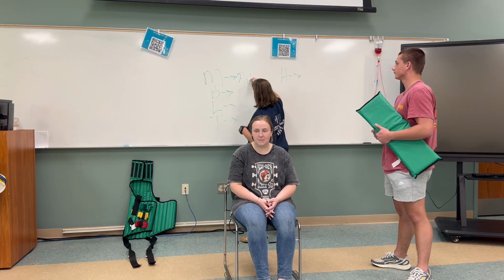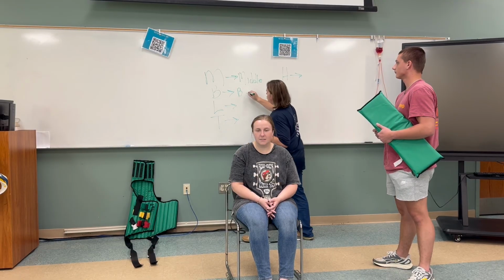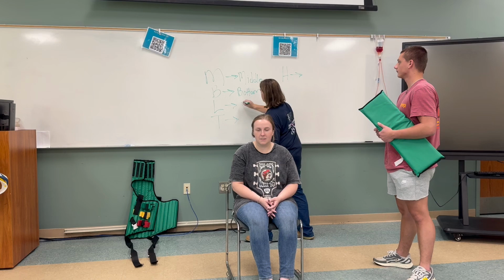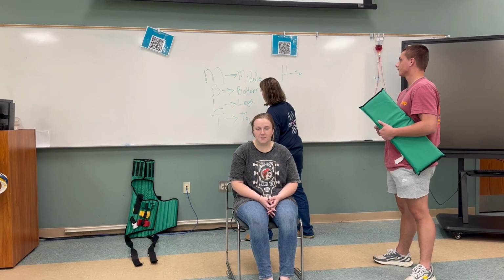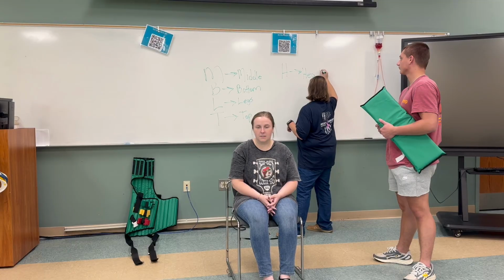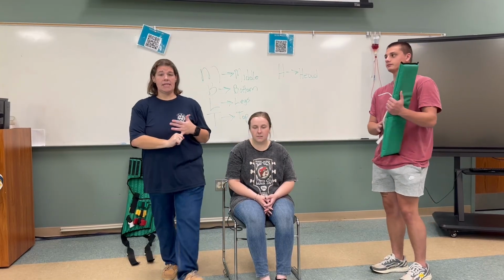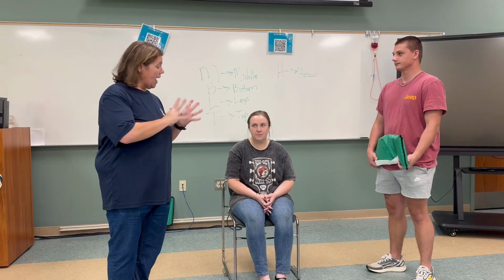So this would be middle strap. This will be bottom strap. This will be your legs. This will be the top. And then this will be the head. As you know, every time you place somebody and you want to secure them, whether it be a backboard or anything, the head is the last thing that is secured. So we're going to start to show you how to use this.